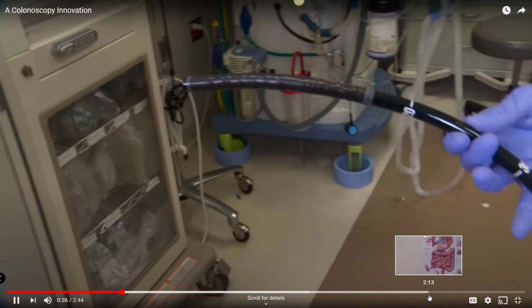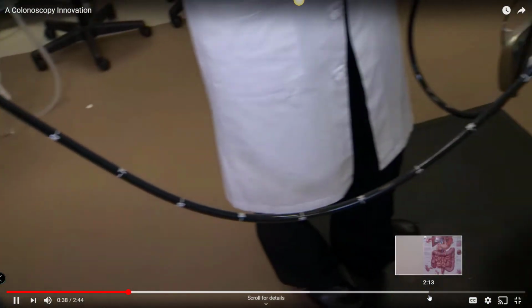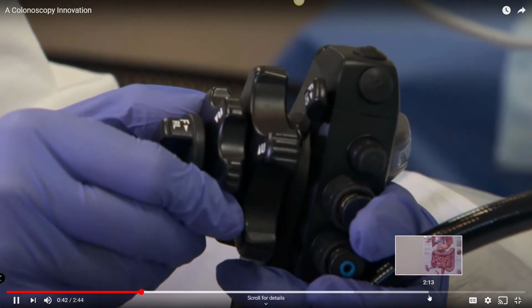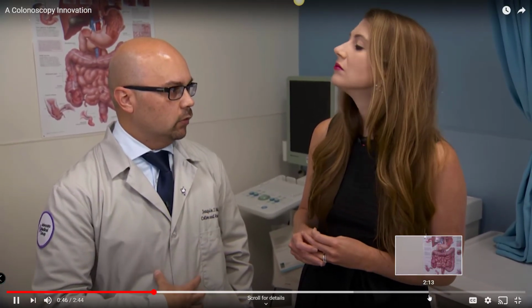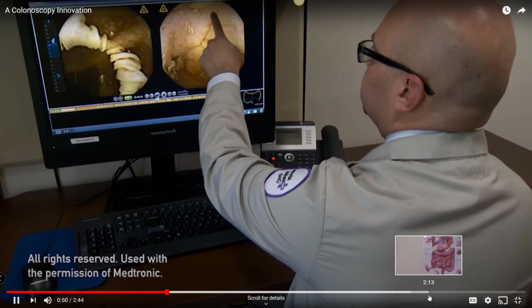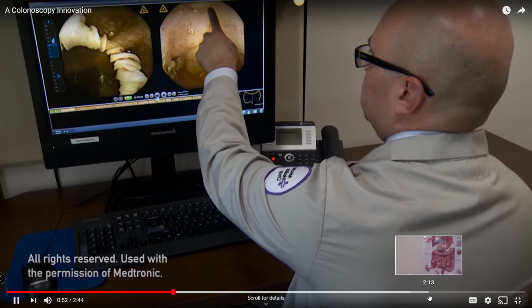That seems very different from the traditional colonoscopy. Yes, a traditional colonoscopy, you have sedation with anesthesia. Your doctor will put a flexible camera into the body and take a look to see if there's any abnormalities. This one, you still have to take a medication that cleans the colon so that we can see clearly, but you don't need the anesthesia. You don't need to take time off of work. You don't have any recovery time. In fact, a lot of patients will take the pill at the doctor's office and then go on to their day at work.